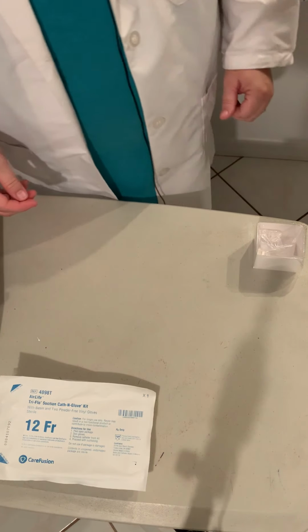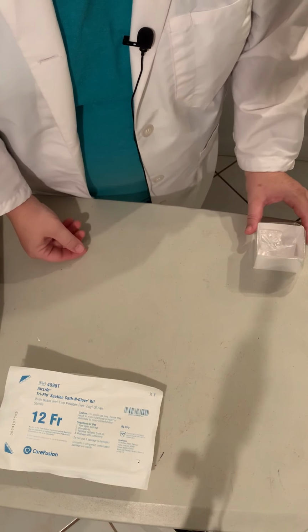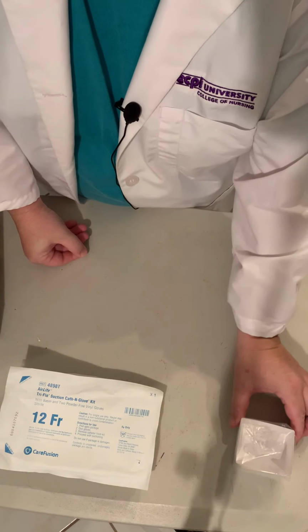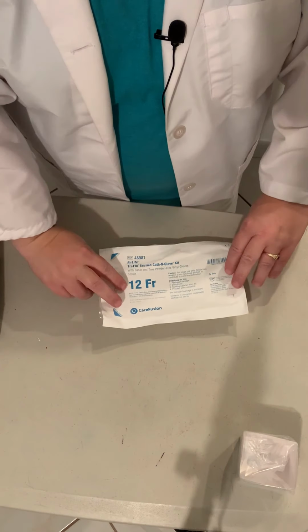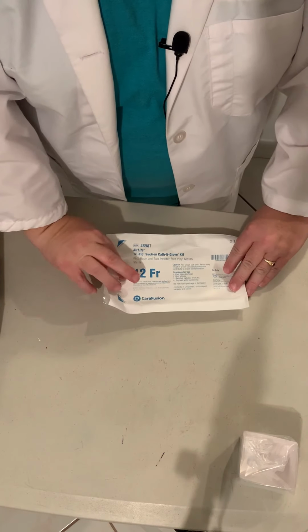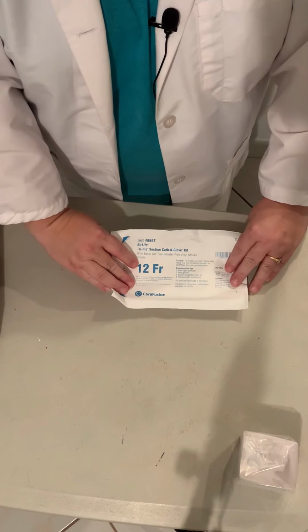Okay. So now we want to get our gloves on. For the sake of using the front of this table, I'm going to push this to the back, making sure I don't touch that upper part. Okay, and I'm going to pull this forward. So I'm going to try these gloves here and see what I can do. Sometimes they're tricky, and so I always bring an extra pair just in case.